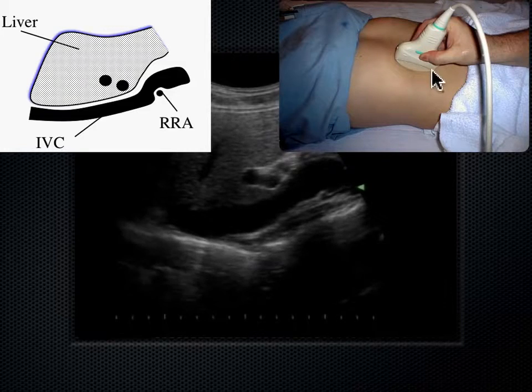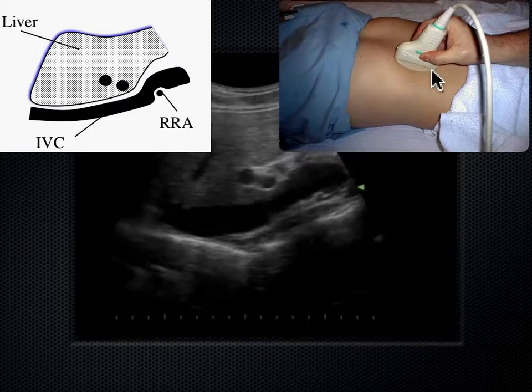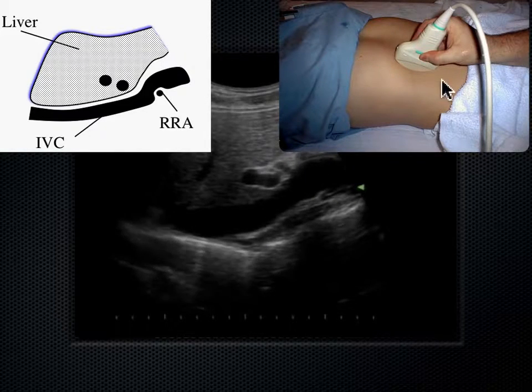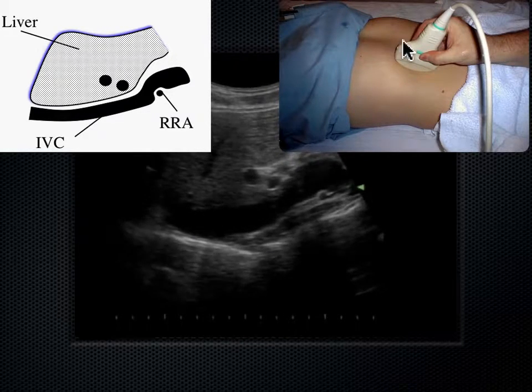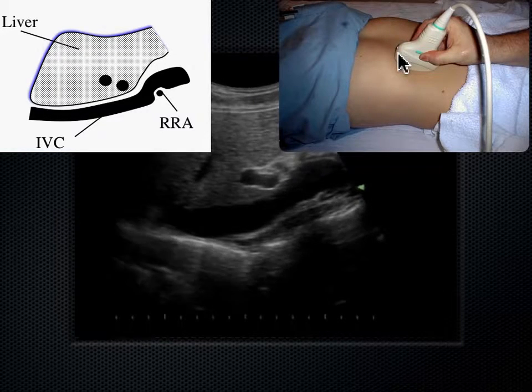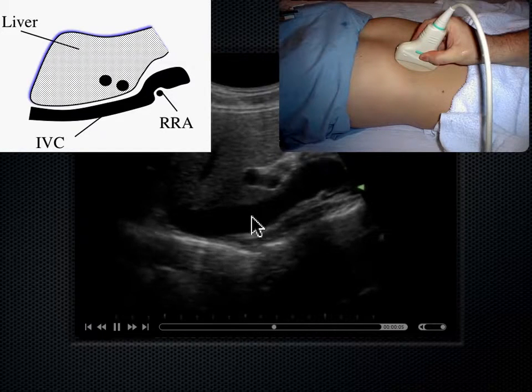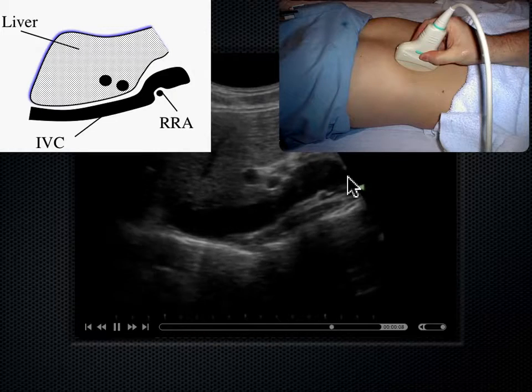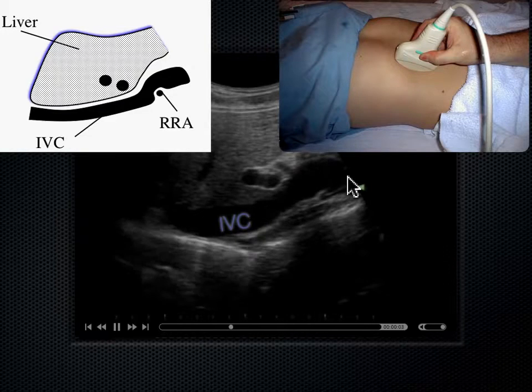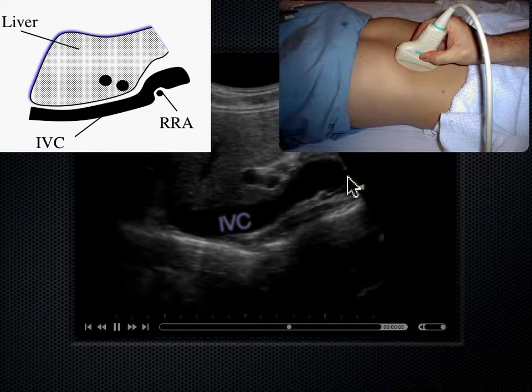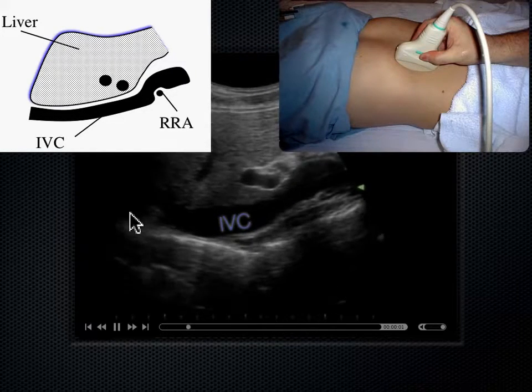Look at where the probe is. This is sort of the midline of the body. If I come just to the right of midline, that's where I'm going to see this vessel coursing underneath the liver—that's the IVC. The IVC runs up the right side of the body. Just as the aorta runs down the left side of the spine, the IVC runs up the right side, bringing blood back towards the heart.